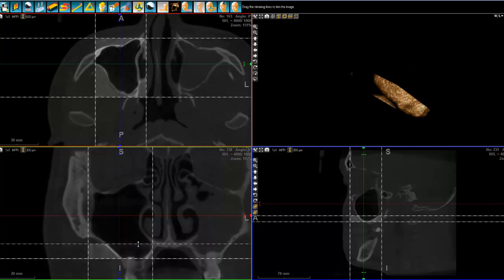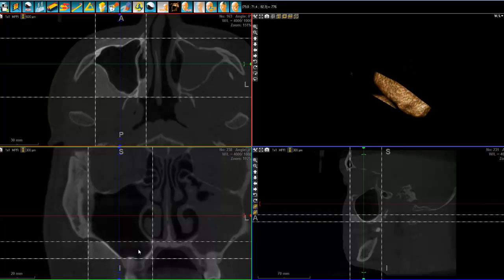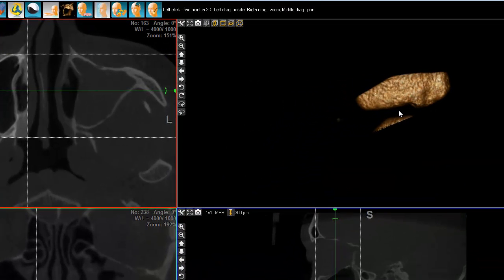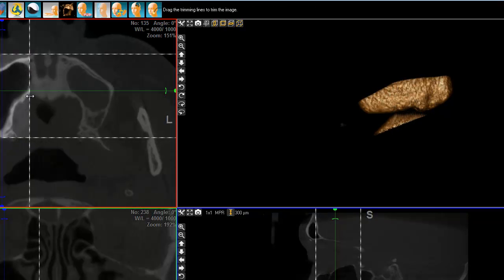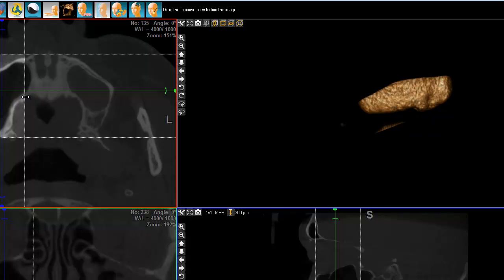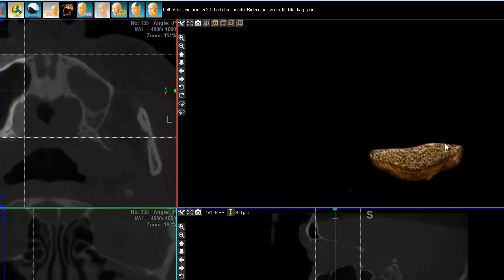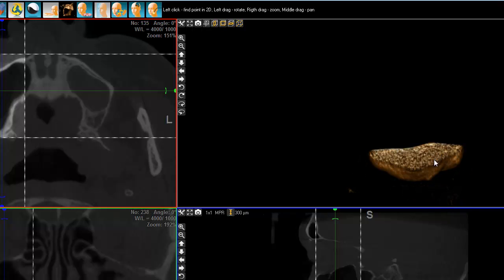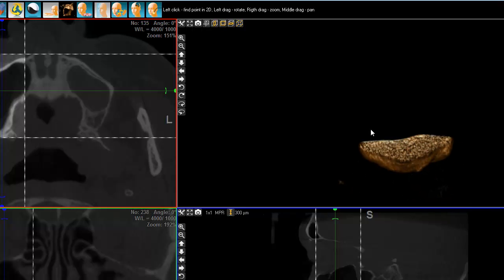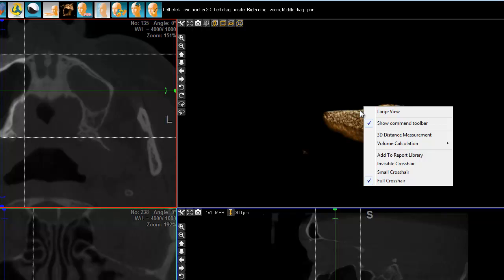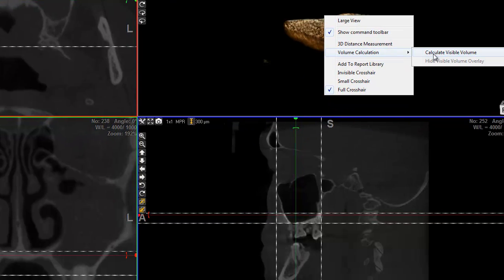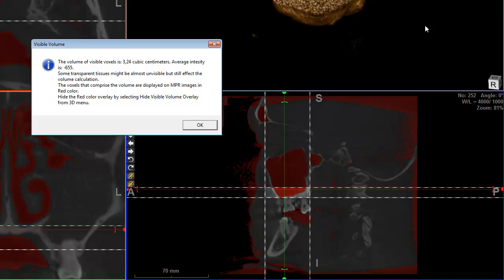I simply drop the framing and trimming here. There's still a little bit of a problem with this small section, but it's going to disappear. I can add a little bit of definition, playing with windowing. The next step is simply right-click, volume calculation, calculate visible volume. And here you go.